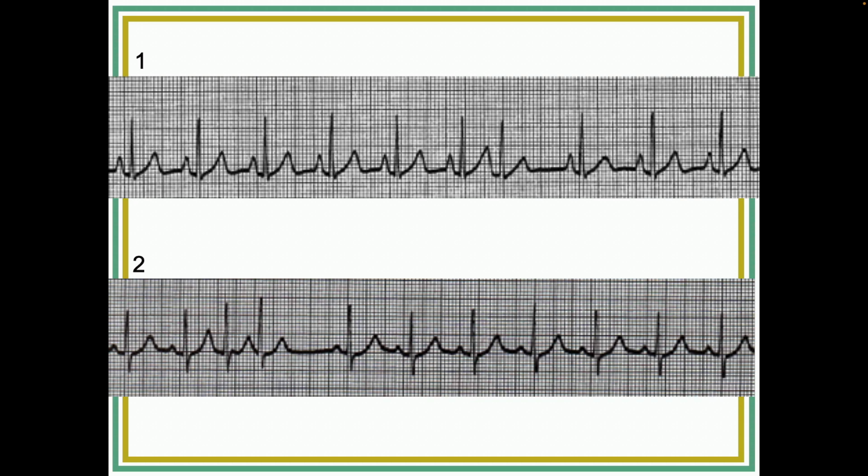Is that I want you to identify the underlying rhythm first, okay? Now, a suggestion to you, and this is a great idea throughout all your ECG recognition, over and over again, you're going to have a strip where most of it makes total sense, and then there's something weird happening in part of it.